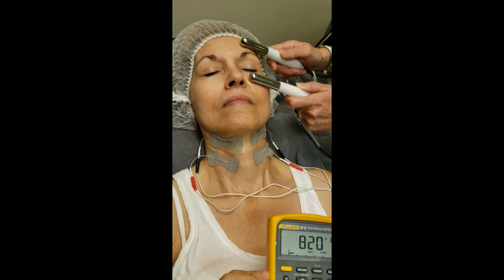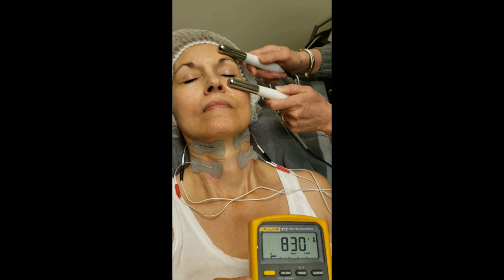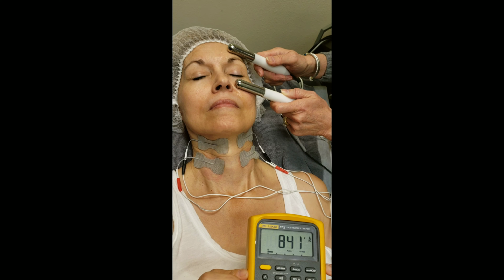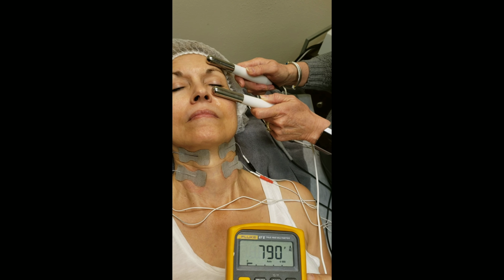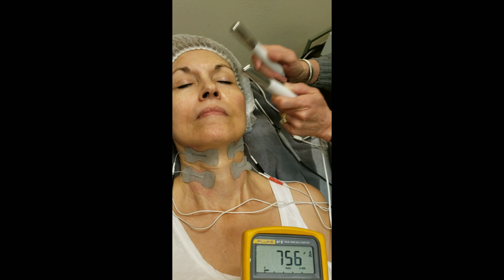That's what it's requiring for this particular client. So we're about 700, 800, depending on the hydration level for that day. So I would say about 800 is average. So you can lift the probes up now.